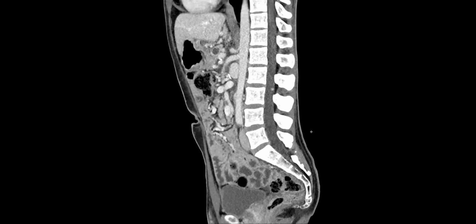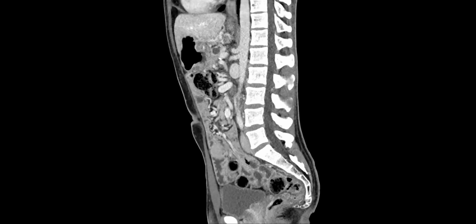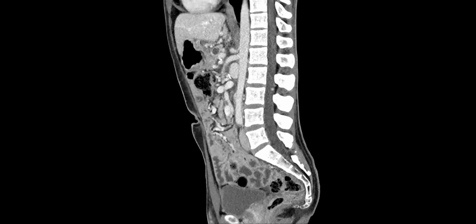Fluid, yeah. Gotcha. Okay. And then there's your hemangioblastomas. Wow, the spinal canal. Yeah, that's subtle. Yes, and that extratesticular lesion, cystadenoma. This is the left side they resected, the right side they're monitoring.